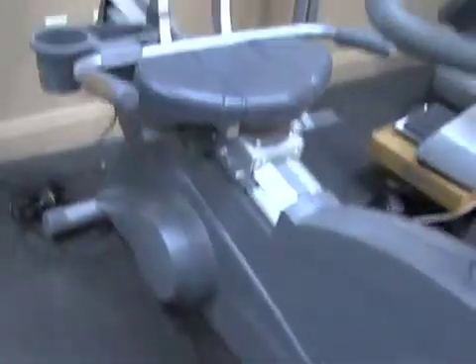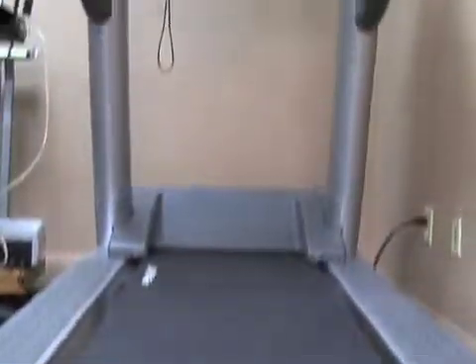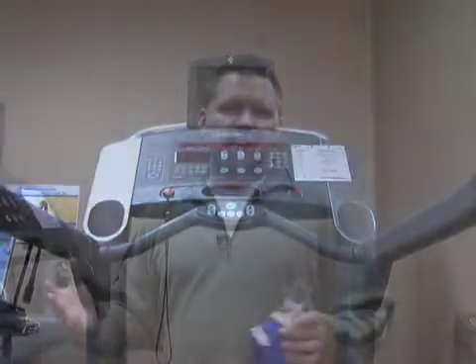Just like last time, we're going to be trying to measure your breathing. You're going to wear a mask, we're going to hook you up to this machine right here, our NuLeaf equipment, and then we're going to have you get on a piece of equipment — either a bike, which is right here, or also a treadmill. Treadmills are the most common that we use. It's the easiest to use for a majority of our population, but if you have injuries or anything that's going to prevent you from being comfortable on a treadmill, we will use an arm cycle or even a recumbent bike.